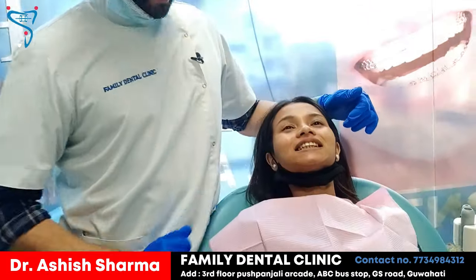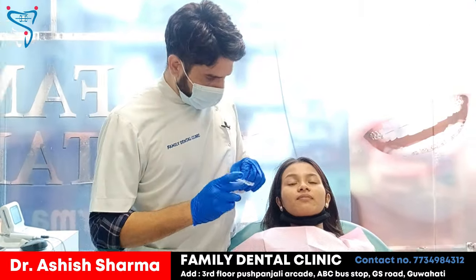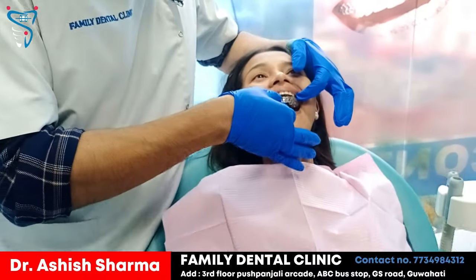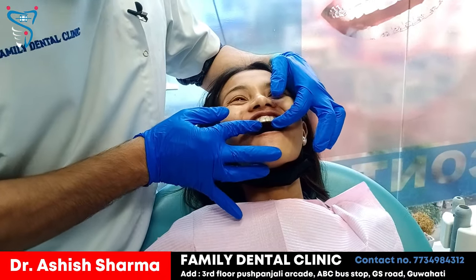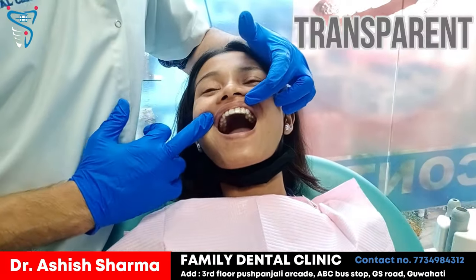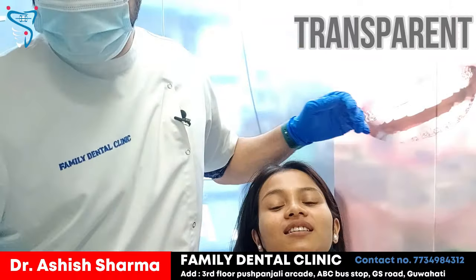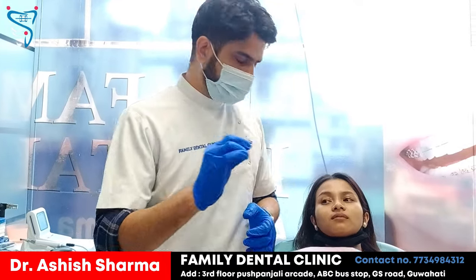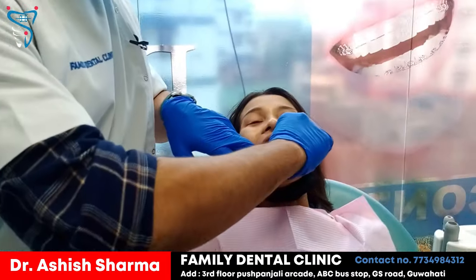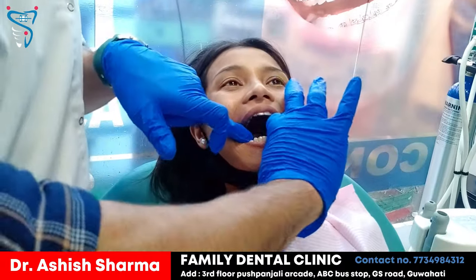Now moving to the patient — as you can see, all the teeth are aligned and have come into proper position. Are you happy with your smile? So this is the upper retainer, the maxillary retainer, which I am going to put on the upper teeth.